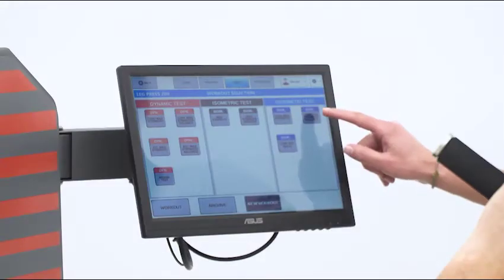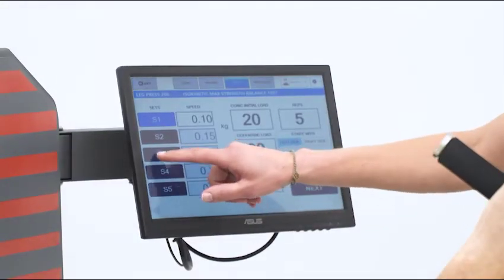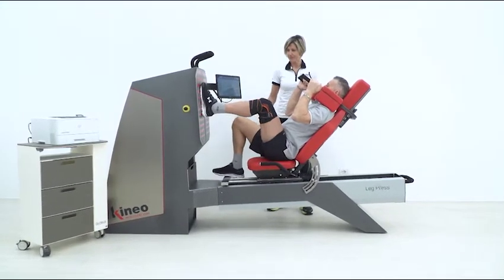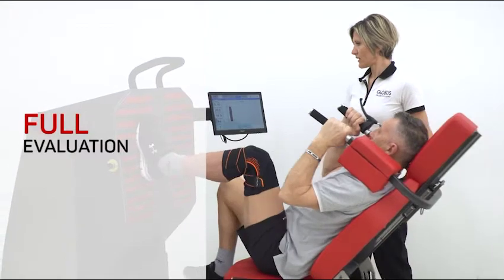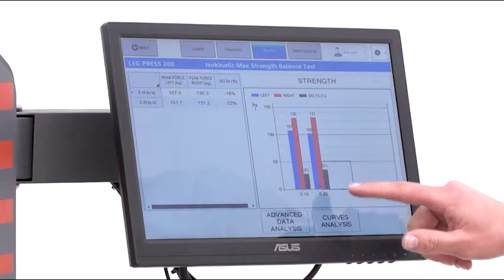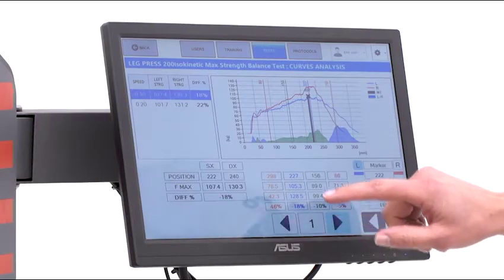Kineo allows a comprehensive evaluation in closed kinetic chain with isokinetic and isometric tests. By evaluating maximal strength and possible unbalances between the limbs, it is possible to customize individual training protocols and optimize recovery time.